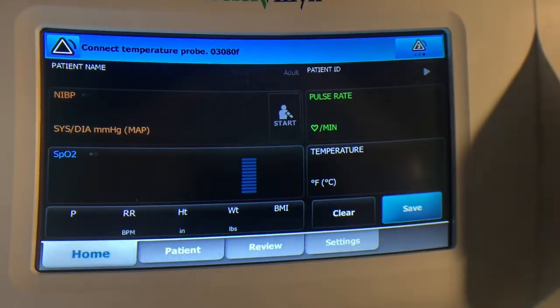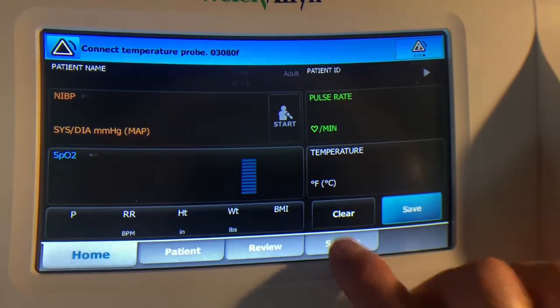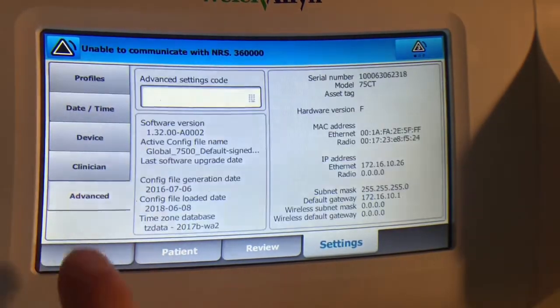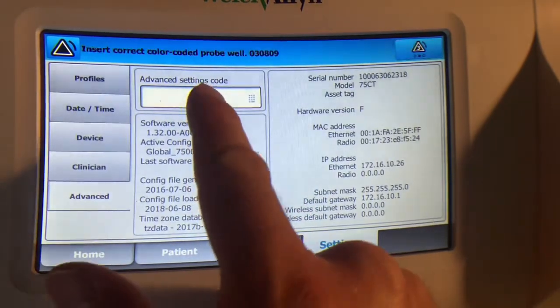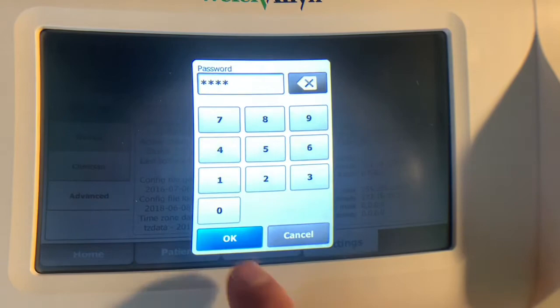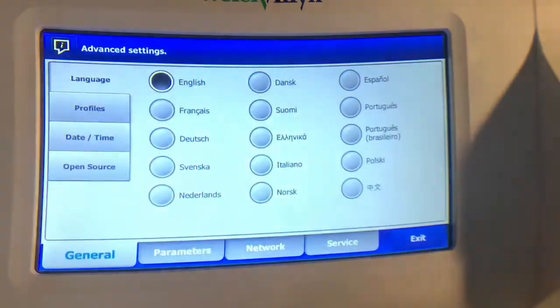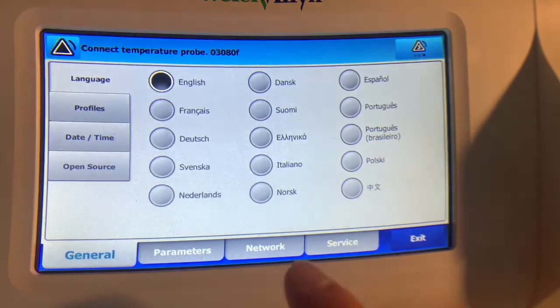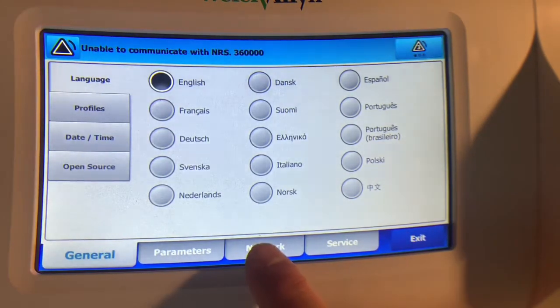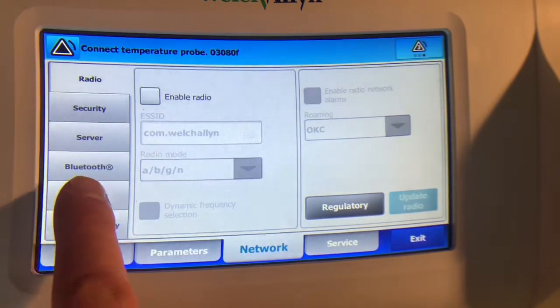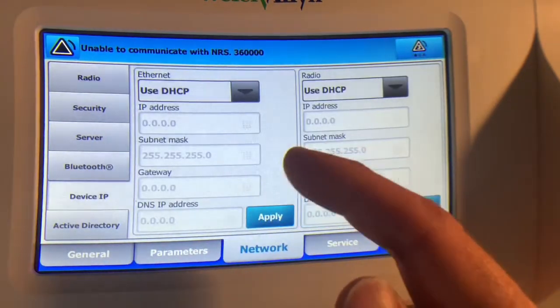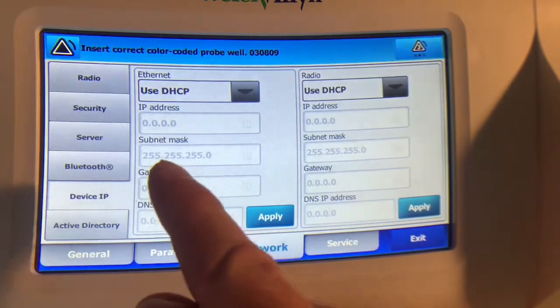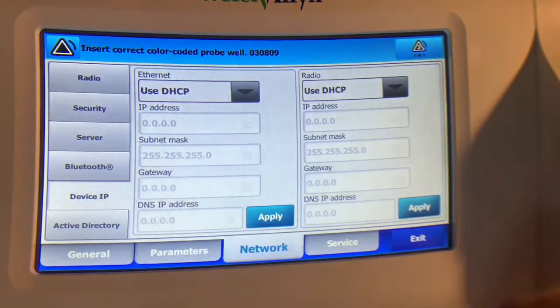I'm going to go to settings, then to advanced. I'm going to enter in the advanced settings code, and once you enter that in press ok and it'll take you into the advanced settings. From here I want to go to network and then to device IP. Right now it's using DHCP but it hasn't received a valid IP address yet.